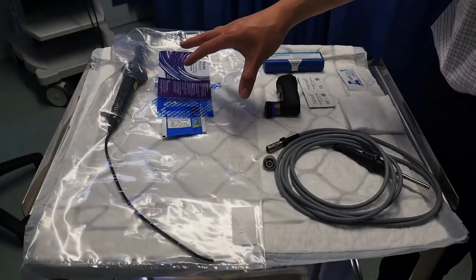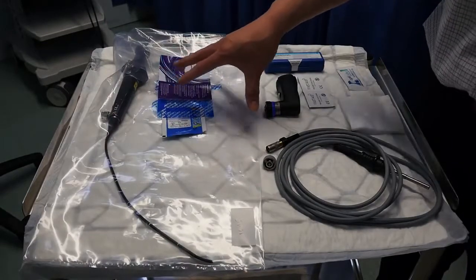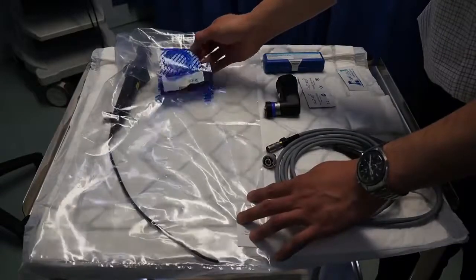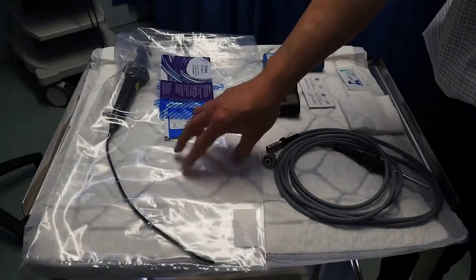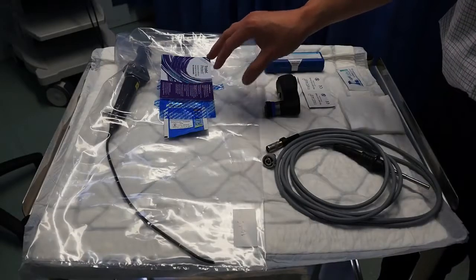First of all, it's important for you to know where the scopes are located. Most of the scopes nowadays will be clean and they need to be tracked, so they've got one-way open stickers here with tracking numbers that you need to keep in the case notes. It's good as well to put a patient identifiable sticker onto the back so that we can keep track of who the scope has been used on.